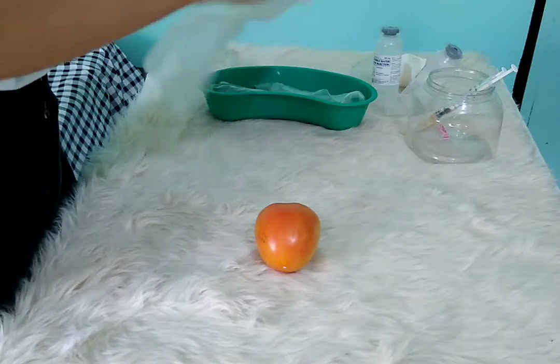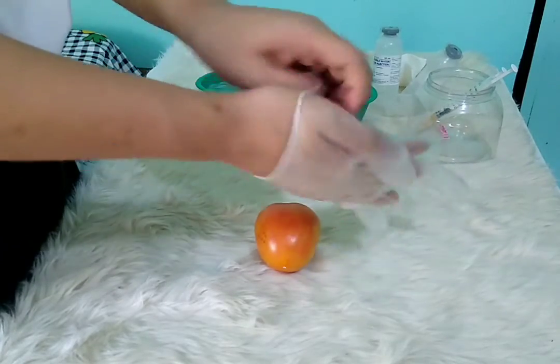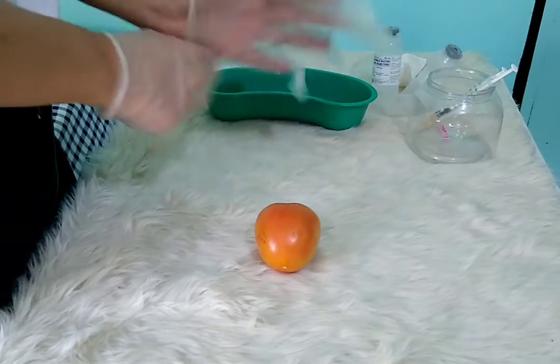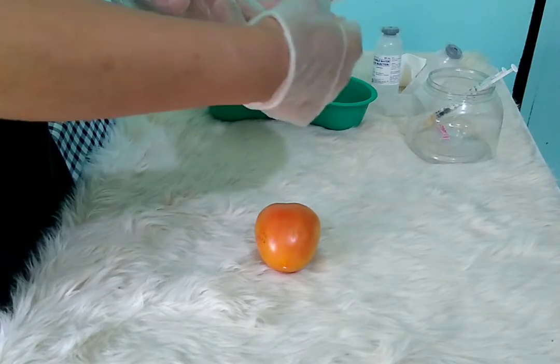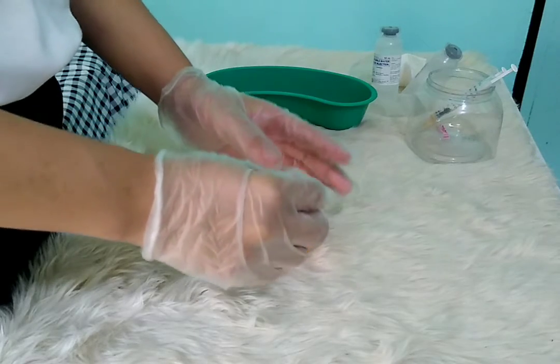Apply clean gloves. Clean the site with antiseptic wipes.